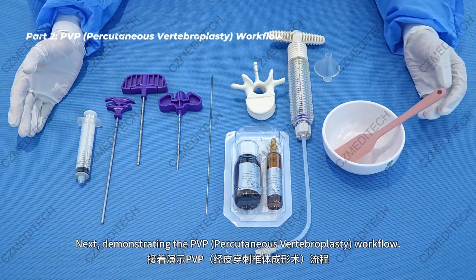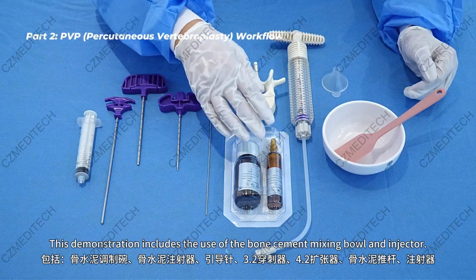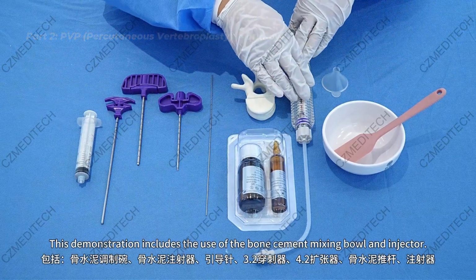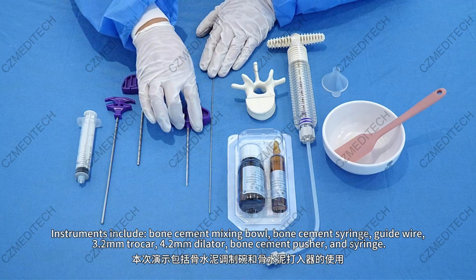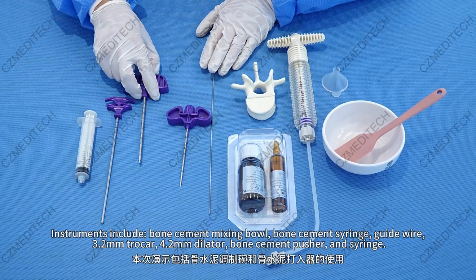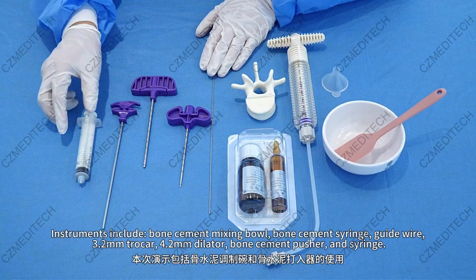Next, demonstrating the PVP percutaneous vertebroplasty workflow. This demonstration includes the use of the bone cement mixing bowl and injector. Instruments include bone cement mixing bowl, bone cement syringe, guide wire, 3.2 mm trocar, 4.2 mm dilator, bone cement pusher, and syringe.